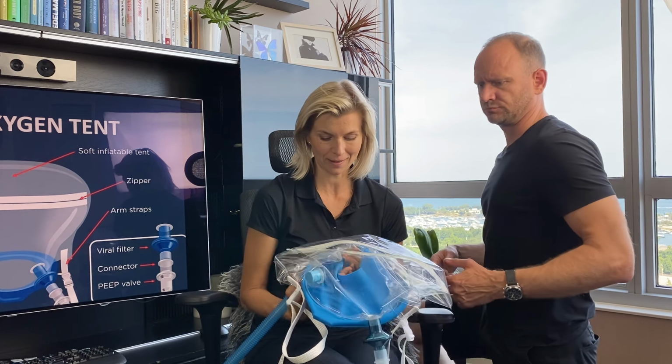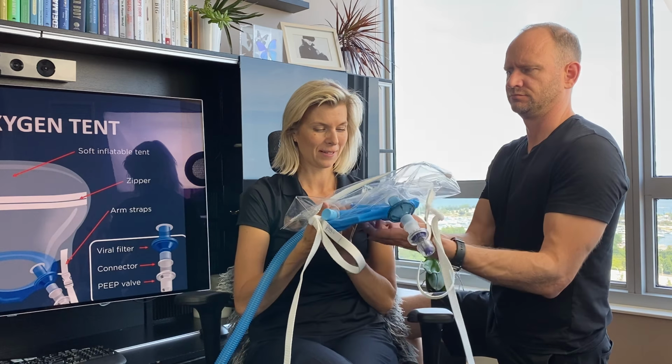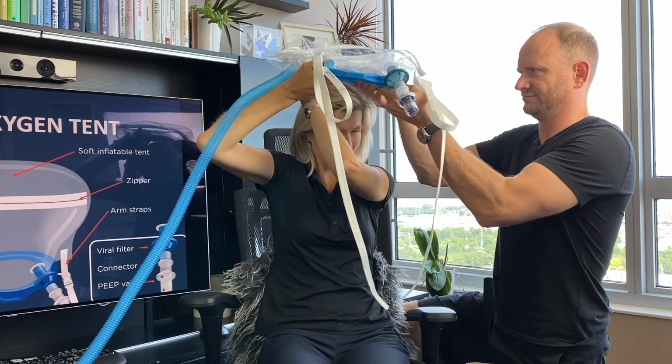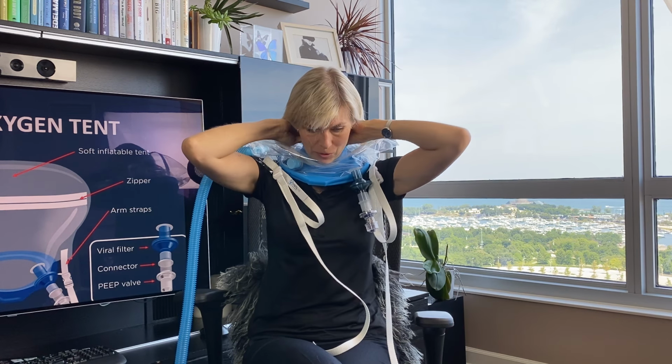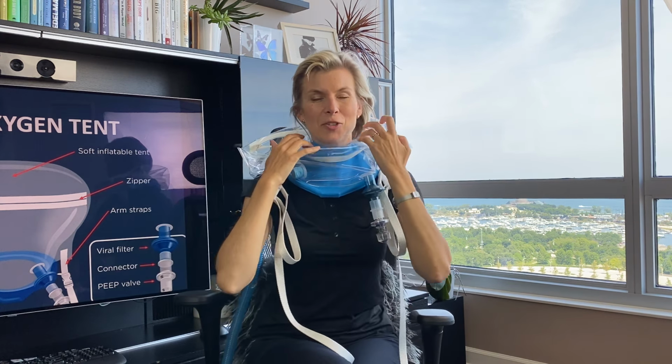All right. To put the tent on a patient, you want to make sure you have 2 people. So why is my suggestion to have 2 people? Because it is a much smoother transition. It's easier for the clinician and for the patient.